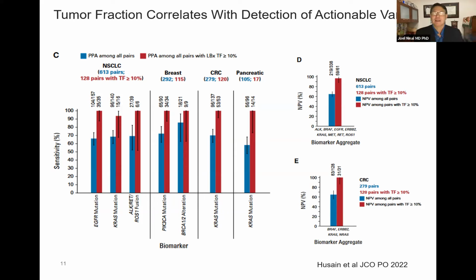I actually feel pretty strongly about this, that the first page of the report, and only the first page of the report, should be: here is an actionable mutation and do this with it.